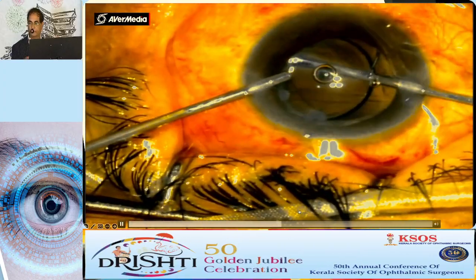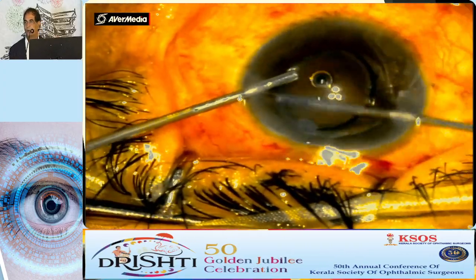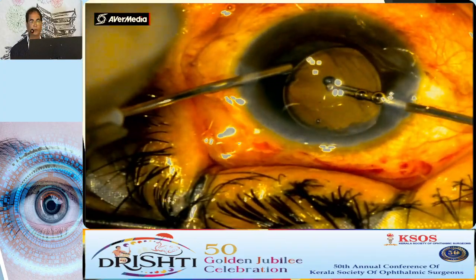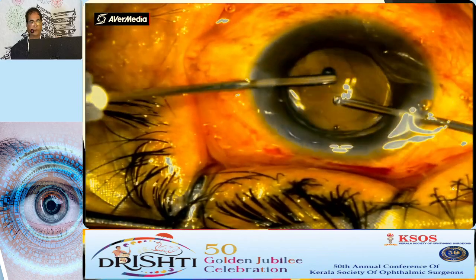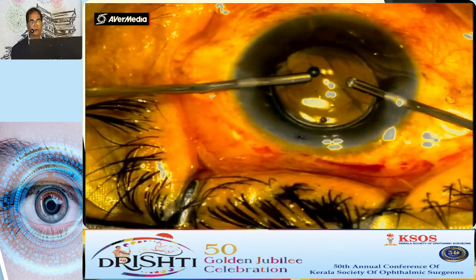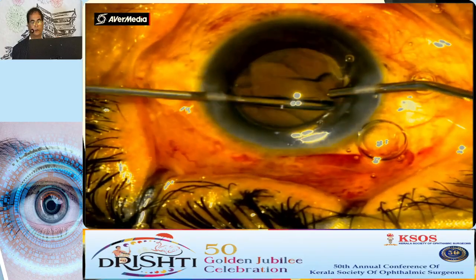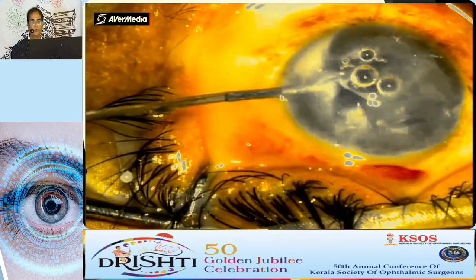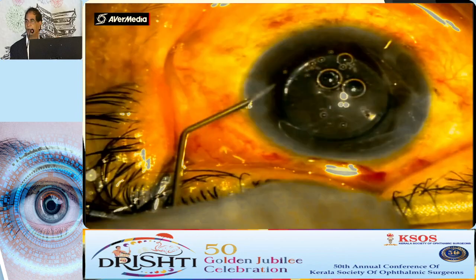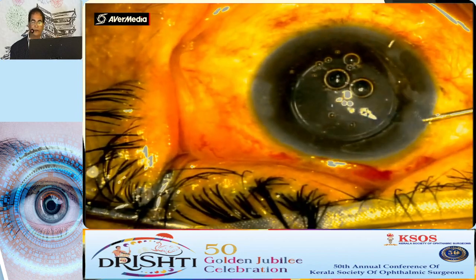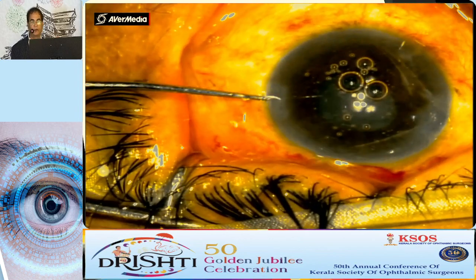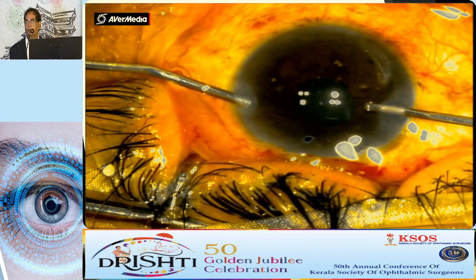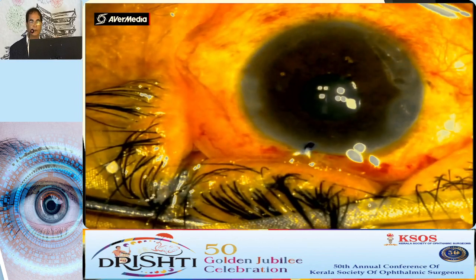You can go back under the lens, do a thorough vitrectomy, then revert to IA mode and aspirate the cortex. I am using triamcinolone to check whether any vitreous strand remains in the section. At the end, you can use pilocarpine if you have a doubt, or use a spatula sweeping over the iris plane.